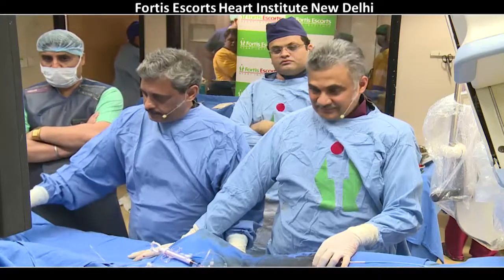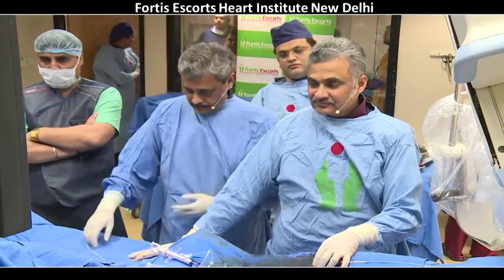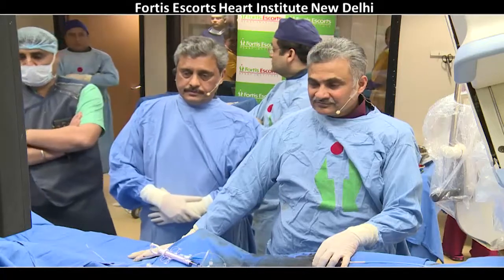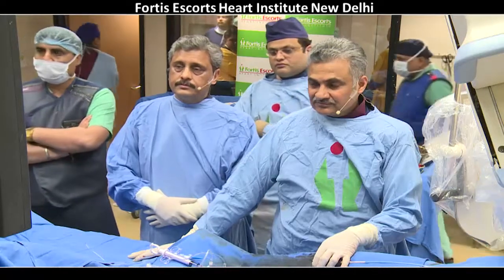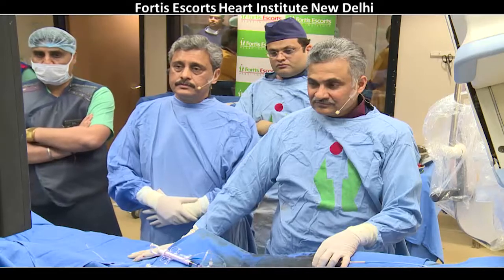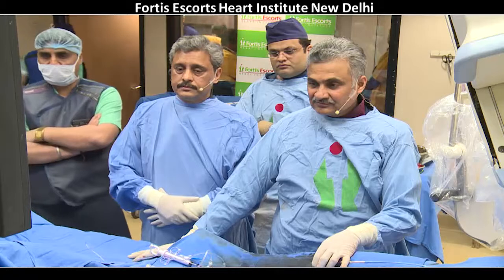Anybody would choose? You can take a call from the audience and have a discussion on it. Watermelon seeding of the balloon obviously causes injury to unstented areas or areas you don't want to treat. And the question is how do you keep it there? Typically, taking longer balloons will help. Sometimes non-compliant balloons, but we use specialty balloons in the United States.